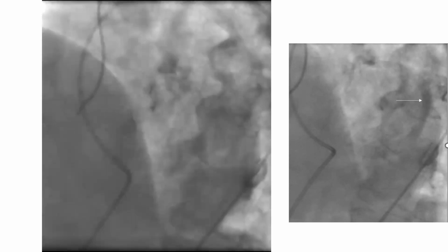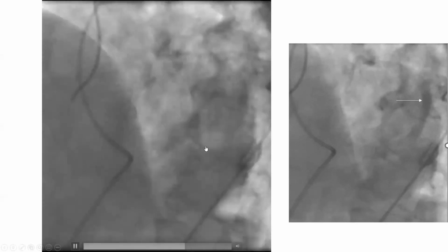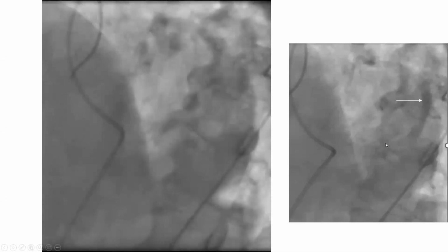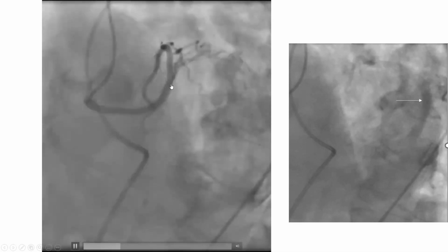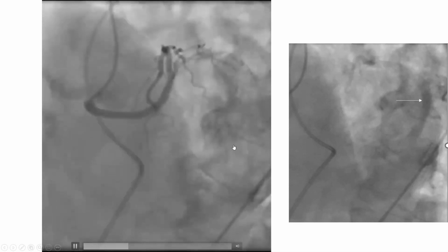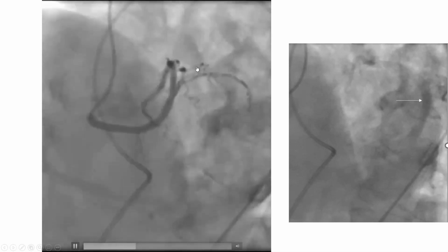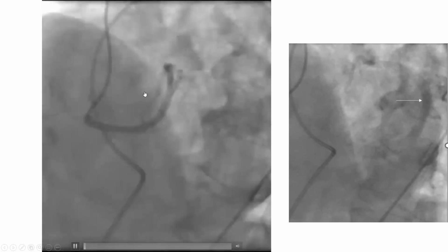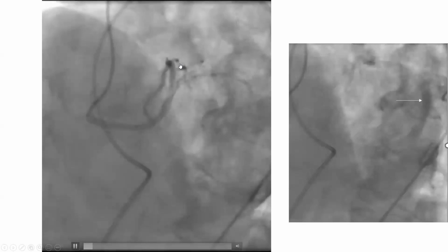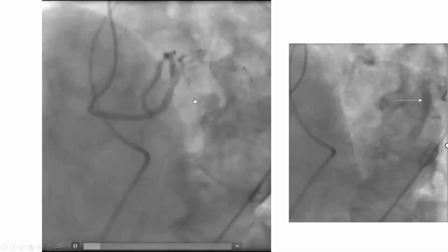So in all those complex angiography in patients with anomalous coronary, when you're confused what's what, wait for the venous phase and see the coronary sinus. You see here, I highlighted it. At the end of that angiography, you see the late venous phase, and you see the coronary sinus filling here, okay? Wherever the coronary sinus is where your left circumflex is. So on this view LAO-caudal, I see the coronary sinus, and I see indeed that there is a left circumflex. It's a tiny left circumflex that gives a tiny OM, but there is a left circumflex.